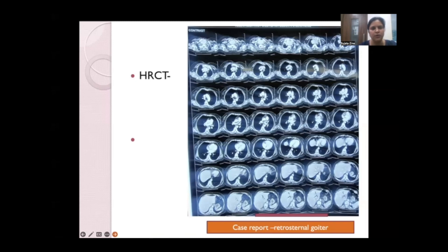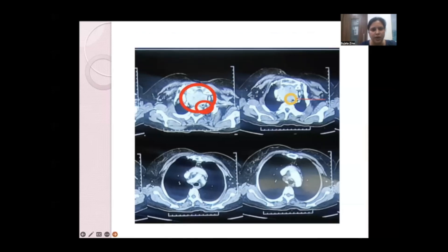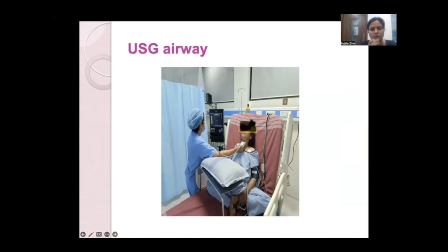On CT scan at the level above the glottic opening there was good airway passage, but as you go down into the subglottis, the tracheal shadow narrowed. The CT clearly showed the thyroid nodule compressing the airway. The narrowest part of the tracheal lumen was approximately 2 mm. However, as you proceed distally, the airway diameter was increasing, meaning the distal part of the airway was not obstructed.